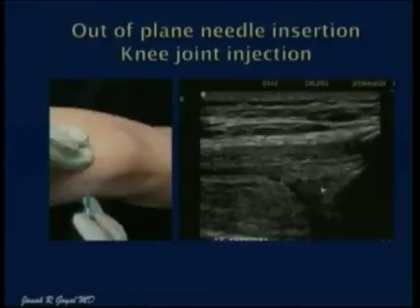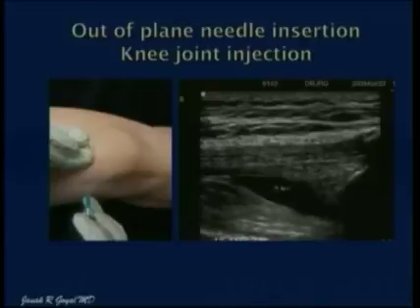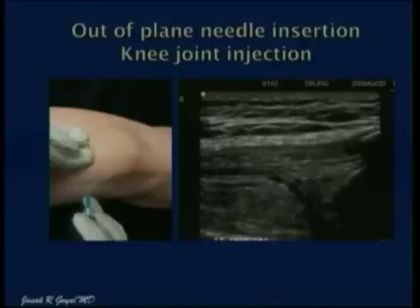Here is a video clip. This happens to be the knee joint. Here is the needle shown as an echogenic dot and filling the suprapatellar recess of the knee joint.